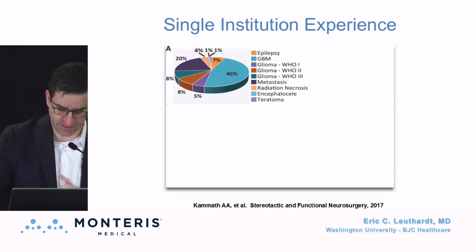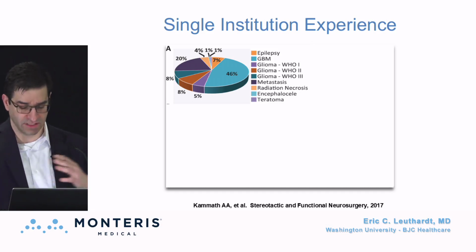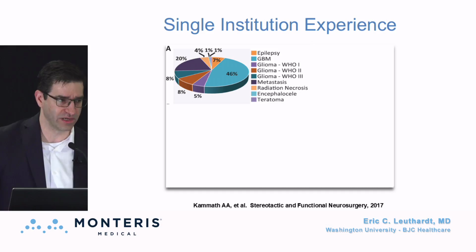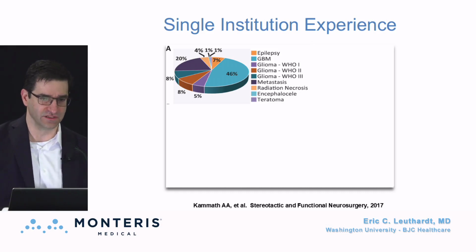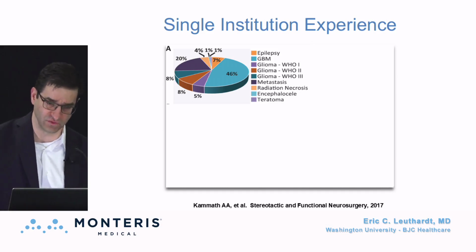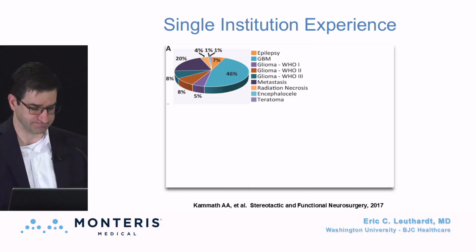I think the other thing, and Dr. Laxton spoke about this, is that we looked at tumor volume relative to complications. And so again, as you get to around 10 centimeters cubed, that's when you can see an increased risk for having some type of complication. Again, not prohibitive, but it's something to be aware of. So kind of the rule of thumb is around 3 centimeters in maximum diameter is a good limit for considering cases with laser. You can go bigger, but you just have to be very aware that you could have more issues with swelling, potentially seizures. And so just a consideration.